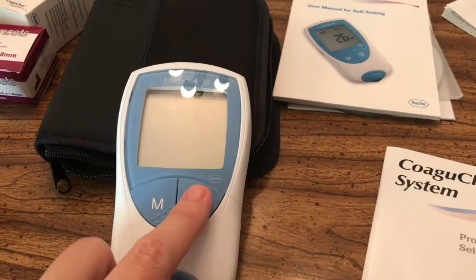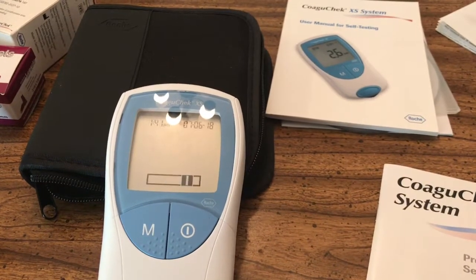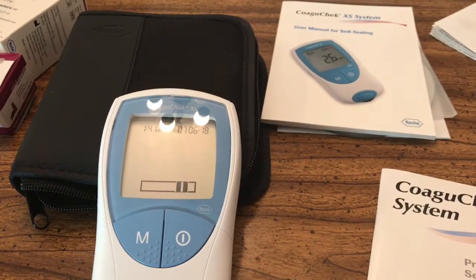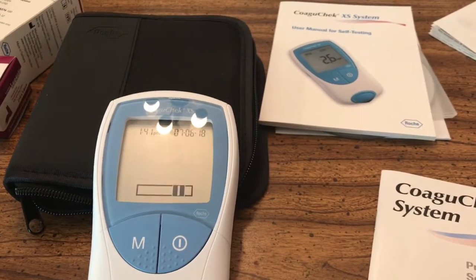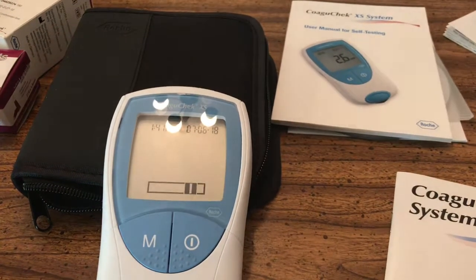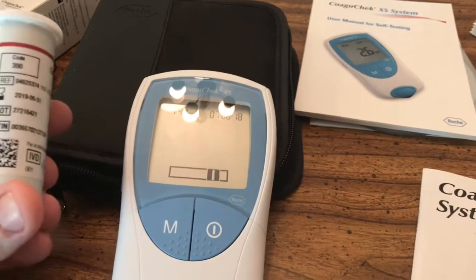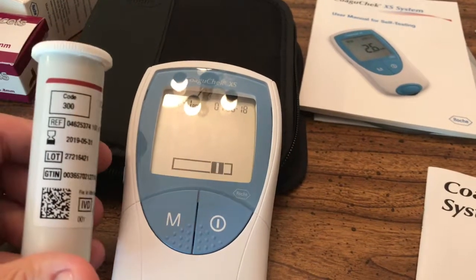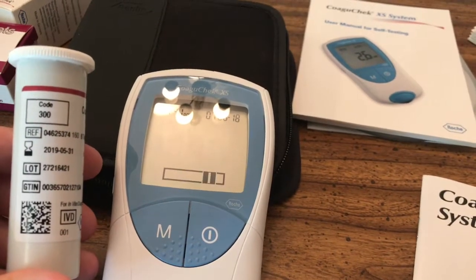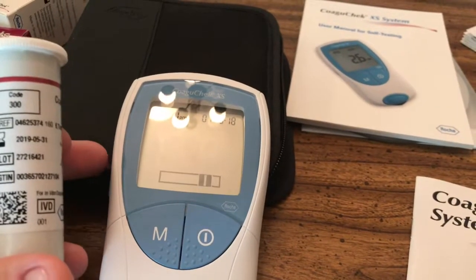The first thing we're going to do is turn on the system by pressing the power button. It's going to go through the process of just logging on and warming up. What it's going to do is flash a number on the screen and we want to make sure that our lot number matches. On each of these strips you'll see a code — code 300. I'm going to insert one of the strips and we'll verify that the number 300 code comes up on the monitor.